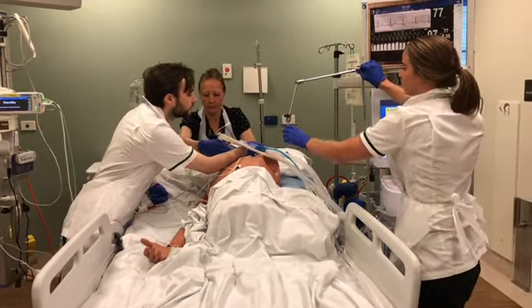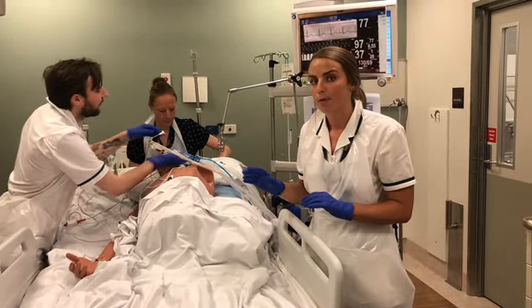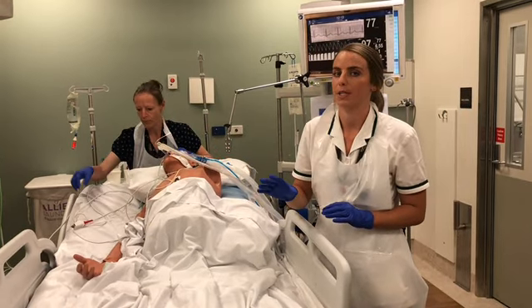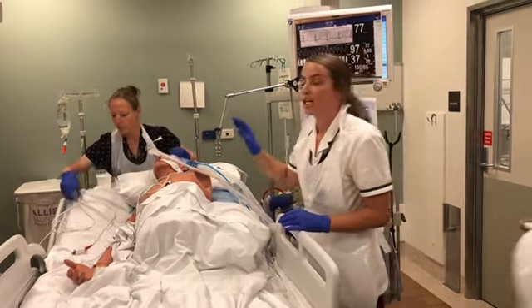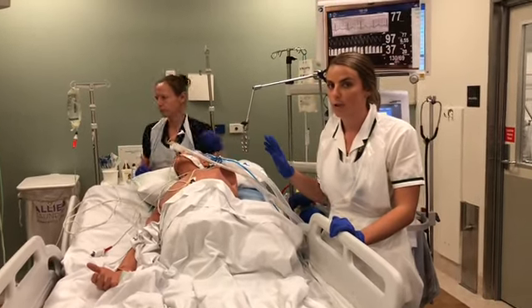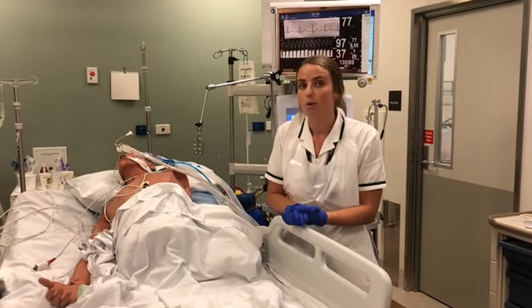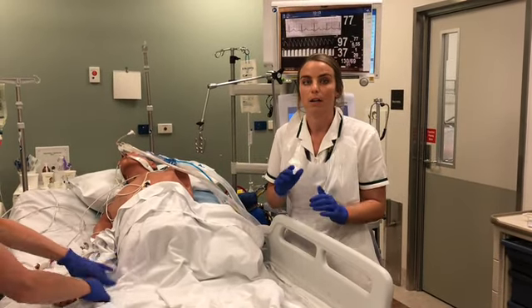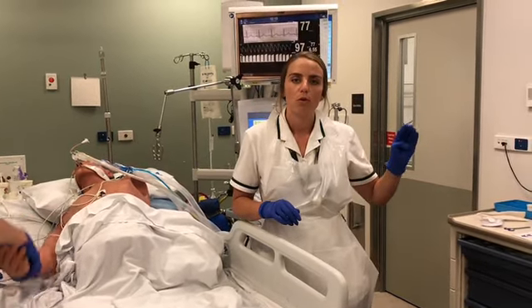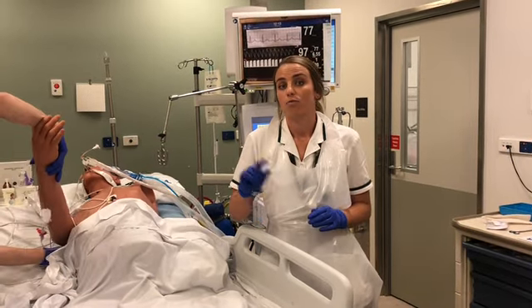Our last part of section C is we do a quick run through, checking we're happy with all safety measures before we step away from this bed space. So we recheck the tube positioning, that we're ventilating okay, all monitoring's on, and that we're happy. We've set those parameters so we know we'll be notified if anything goes out of the limits that we've set. And then lastly, Michael calls out the safety checklist that I've done in the first section to run through quickly before we step away.